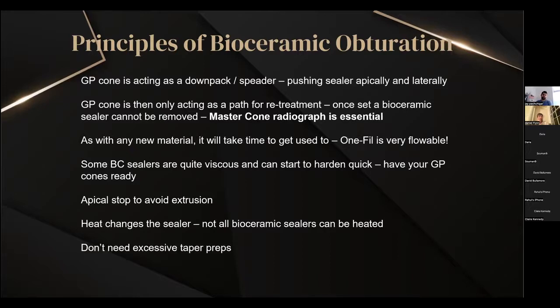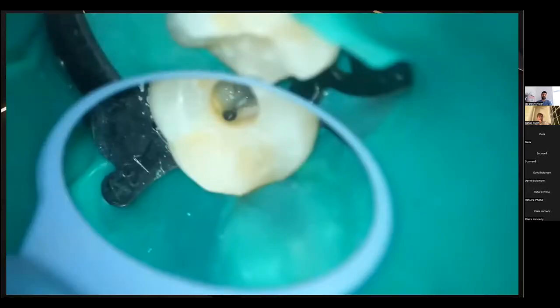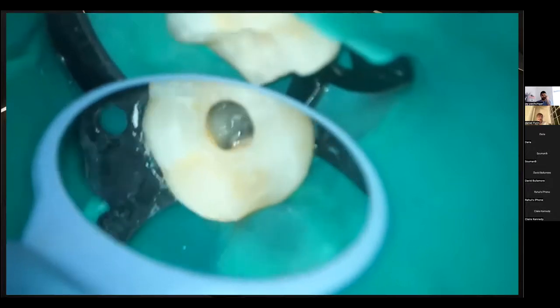And again, when you're able to inject that sealer into the canal, and it is hydrophilic, you don't really need your excessively tapered preps. And really, when you've got these long curved canals, which sometimes you do get both, it really is incredibly easy now to fill canals with these types of sealers compared to trying to get your very, very thin pluggers into these areas.